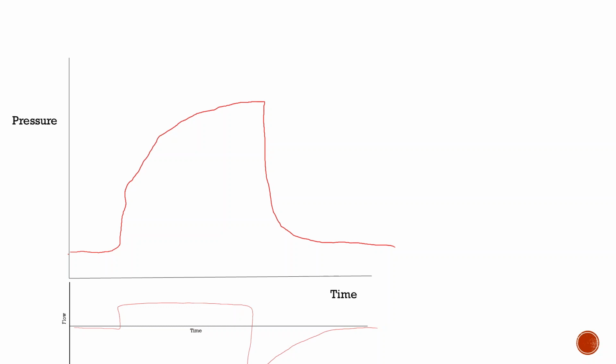Well, this is sort of the inverse of the previous curve. Yeah, exactly. I'm trying to think. That one I could kind of figure out. So you're getting an increase in pressure without, I would guess, adequate inflation. Well, you're not given the tidal volume. No, you're right. But just based on the way the pressure curve is acting at the start of it, it's basically just you're adding pressure.